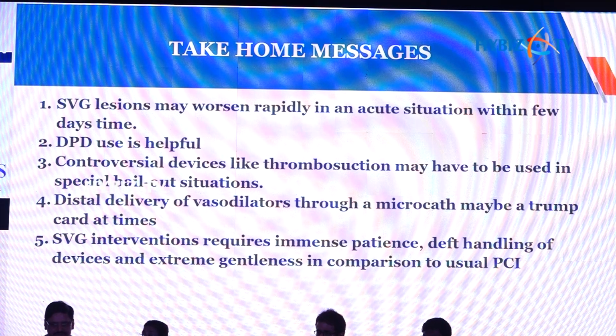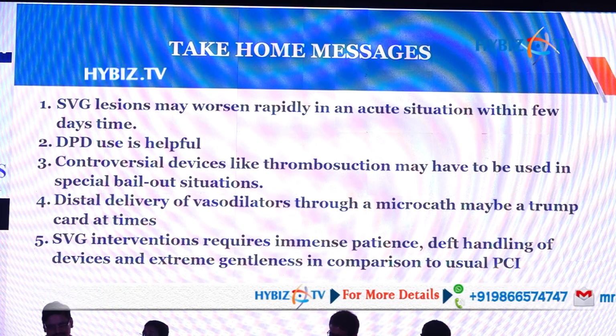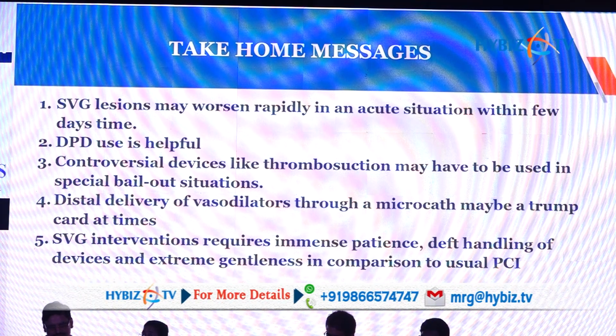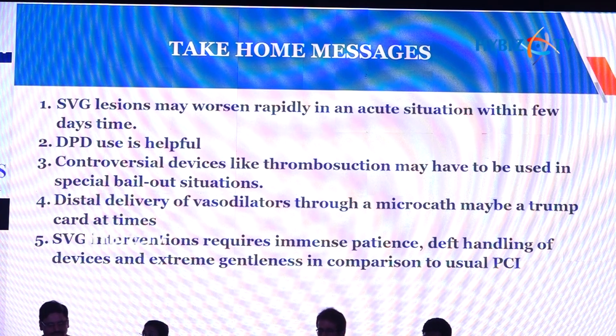SVG intervention has much more morbidity and mortality if you compare it with coronary artery PCI, with more periprocedural MI, and this intervention requires a lot of patience, and you have to handle it very gently, because you can damage the SVG, there might be perforation of the SVG, and with the filter device, if you touch the filter device, or if you try and move it too much, or your delivery catheter is not used well, it is very difficult for the filter to be retrieved. Sometimes it might be very difficult to retrieve, and the case might get complicated.